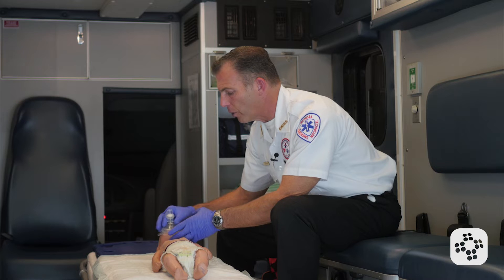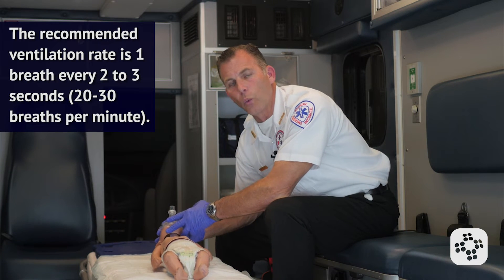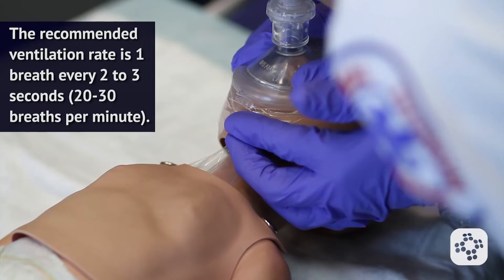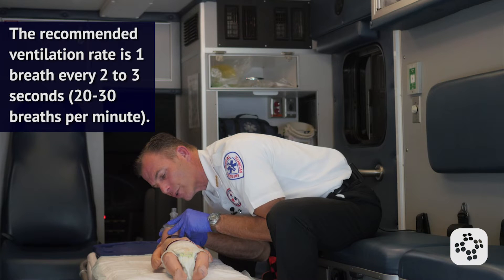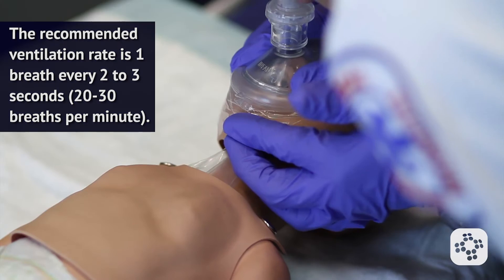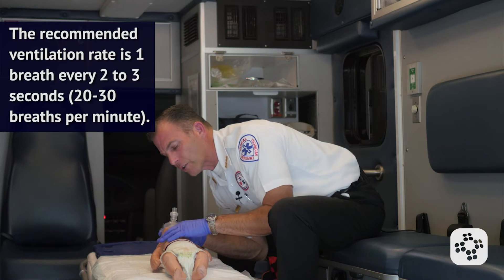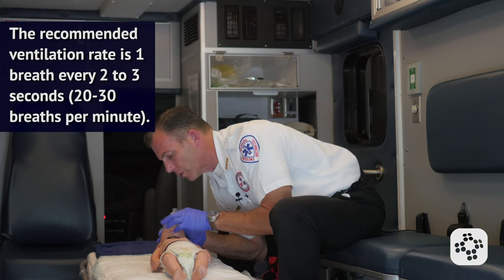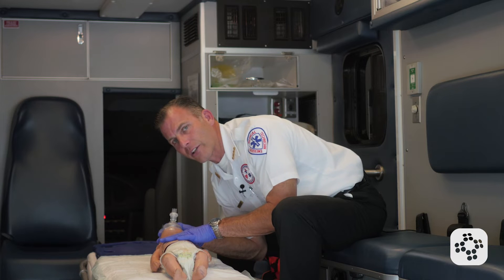We're then going to cover the mouth and nose of the baby with the infant size rescue mask and deliver one rescue breath every two to three seconds for two minutes. We check as we give a breath for chest rise and fall, and we see it goes in and comes back out. We deliver only enough breath that we actually see the chest rise, and then we don't force more in. It's important to know that we're moderating how much air we put in just to elicit that chest rise and fall.